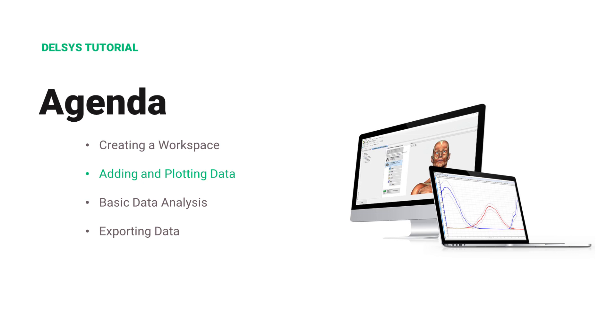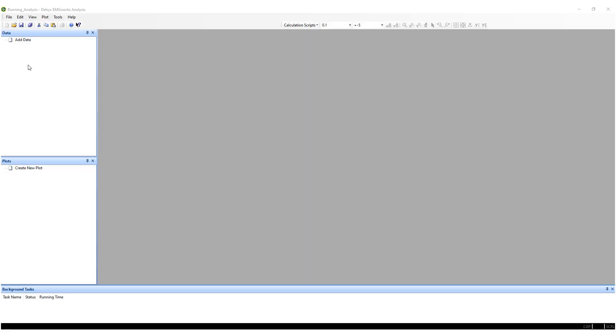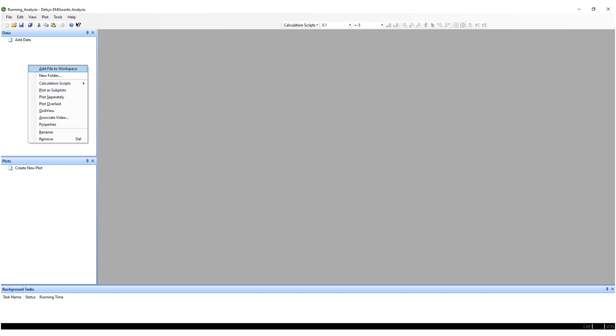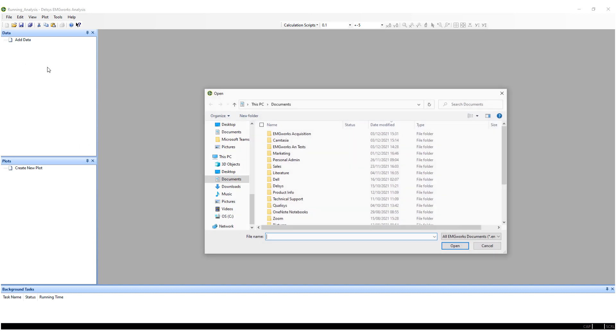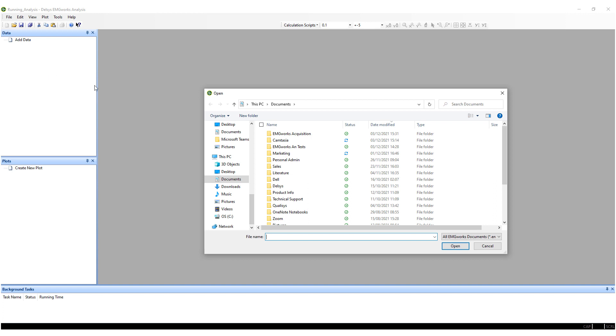Data can now be added to the workspace and plotted through a variety of options. There are various methods of how to add data to the workspace. One way to add data is to right-click on the workspace and choose Add File to Workspace from the pop-up menu.